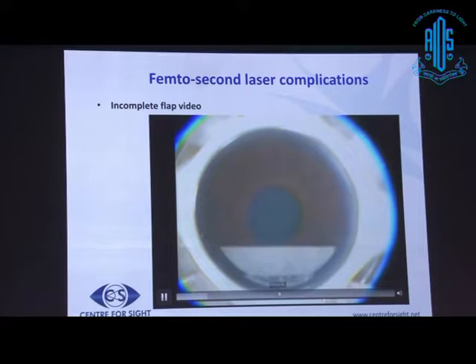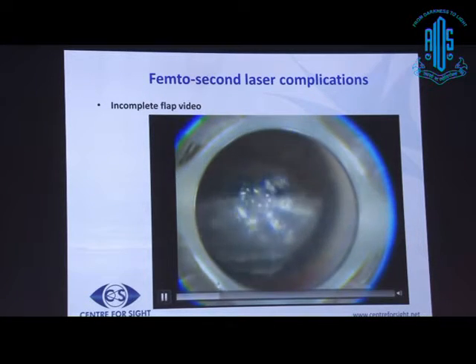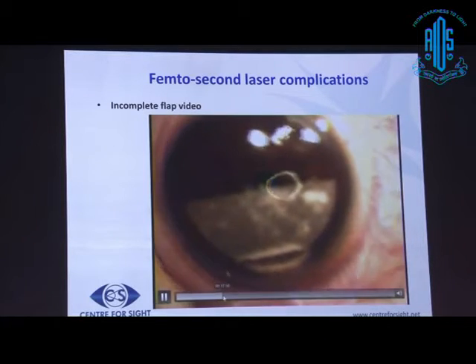The pocket here that is created is to collect the OBL. And now the system starts firing in the raster pattern. In between, the laser has stopped due to some electrical or machinery issue.